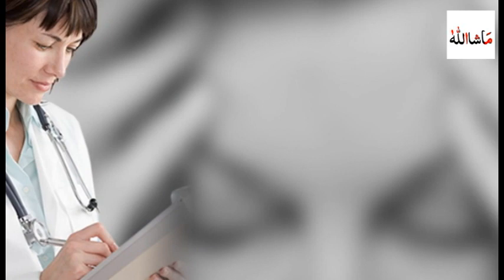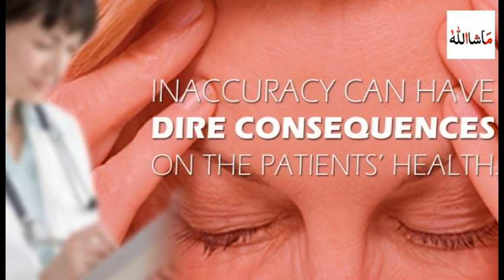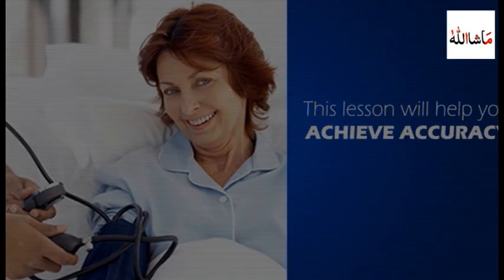Just imagine if you recorded a patient's blood pressure as normal when in actuality their pressure was extremely high and they were at risk for having a stroke. Your inaccuracy can have dire consequences on the patient's overall health. This lesson will help you achieve accuracy when taking blood pressure measurements.